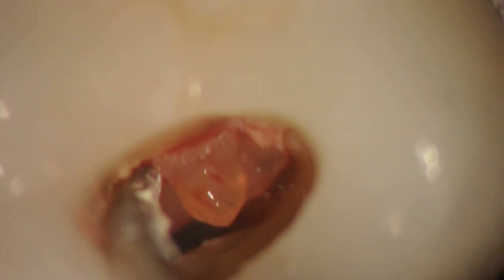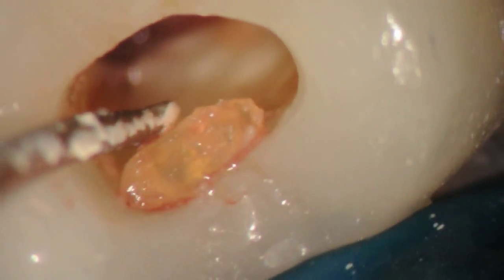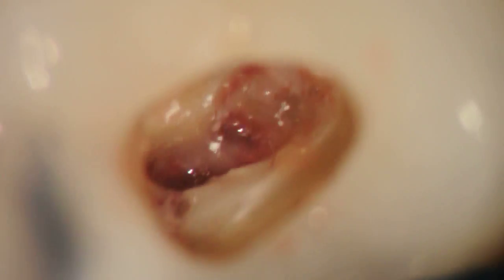That's a huge, huge pulp stone. Just save it — I just wanted to measure it afterwards, so big. Now you can see, once you get that open, that you can see the pulp, or you can see the pulp floor underneath, right? And how it hides it.